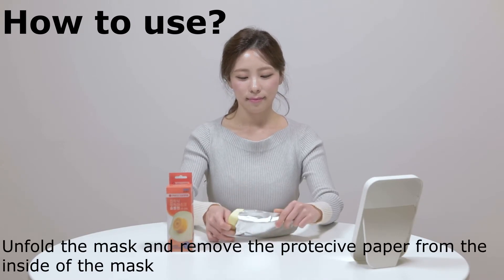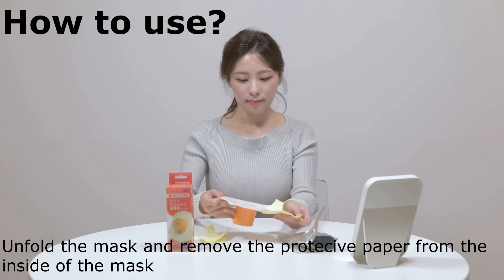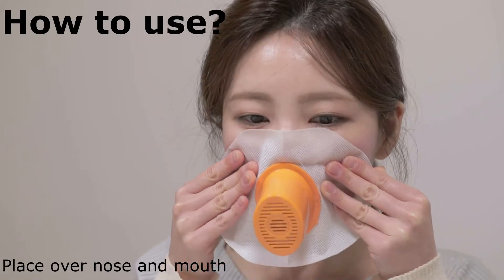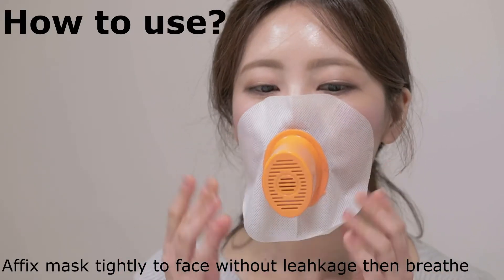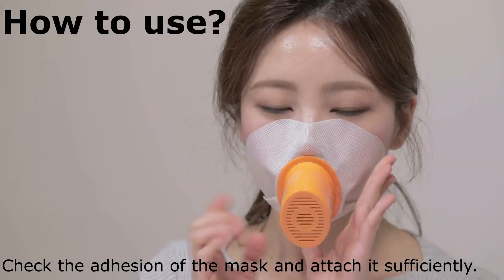Unfold the mask and remove the protective paper from the inside of the mask. Place it over your nose and mouth. Affix the mask tightly to your face without leakage, then breathe. Check the adhesion of the mask and attach it sufficiently.